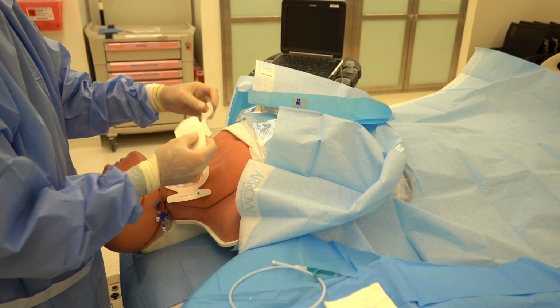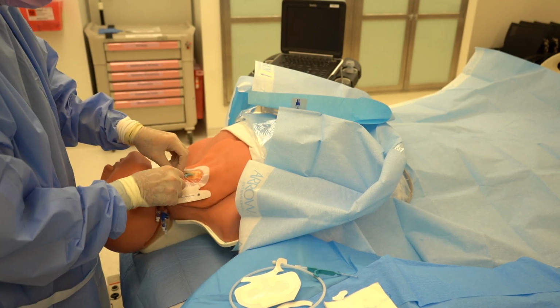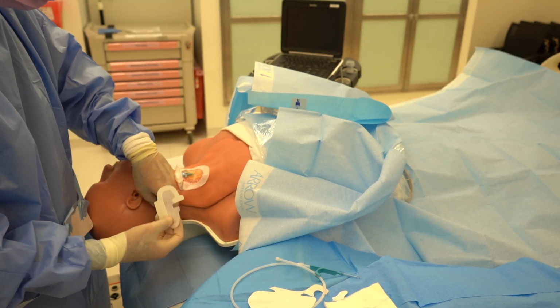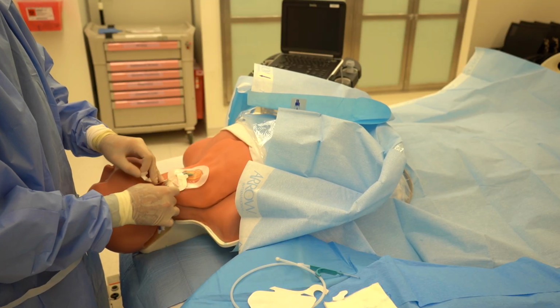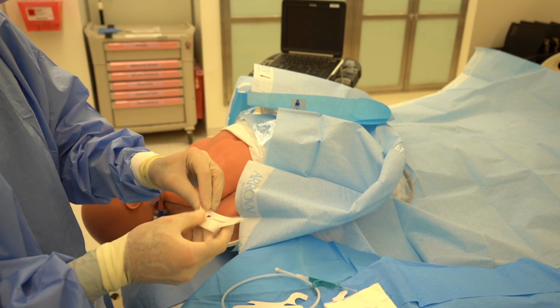There's little nuances to get these catheters and their tegaderms positioned to be less annoying to patients. But upon completion of our tegaderm placement, and then take care of our sharps, reposition our patient.